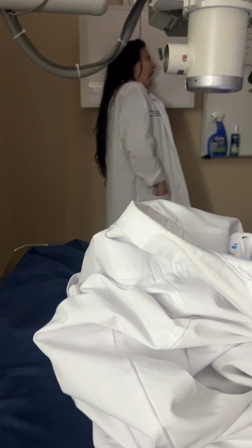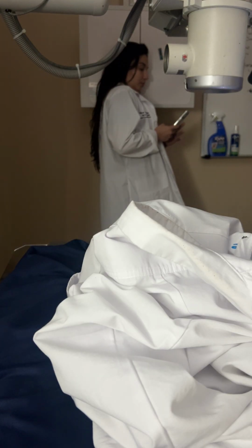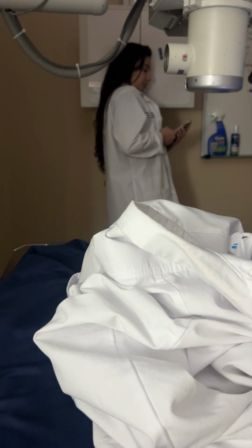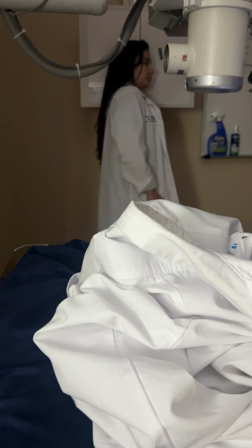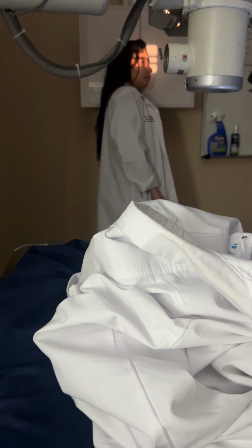This is the body, okay? We basically want to get this flat against the bucky, okay? For the mandibular symphysis, we're going to rotate them 45 degrees toward the IR, okay? So 0, 30, 45, depending on what you want to see, okay? For your final, I'm okay if you do the general survey, which is just keeping them in a lateral, okay?